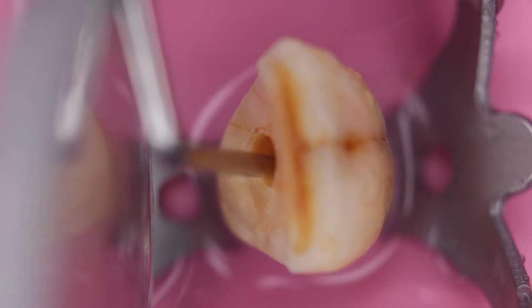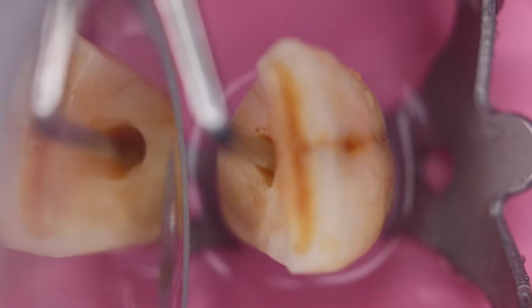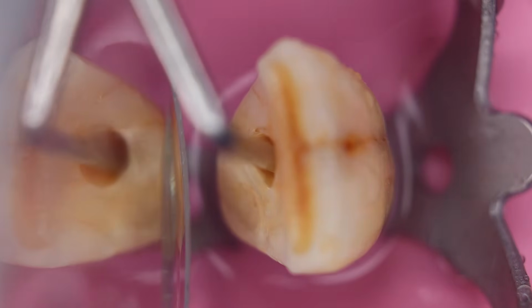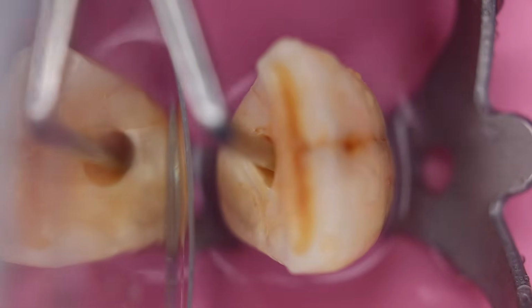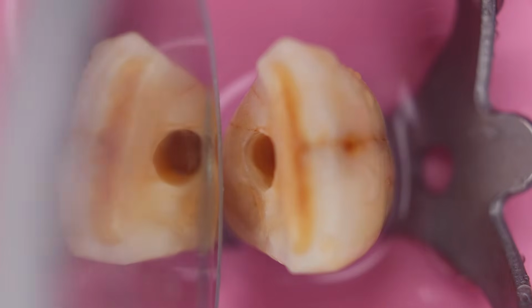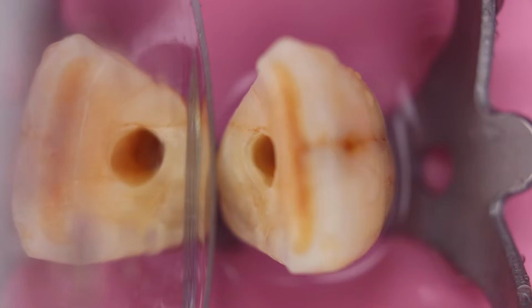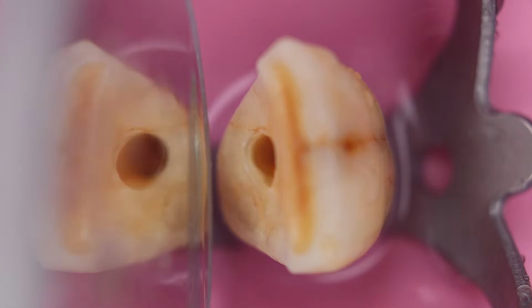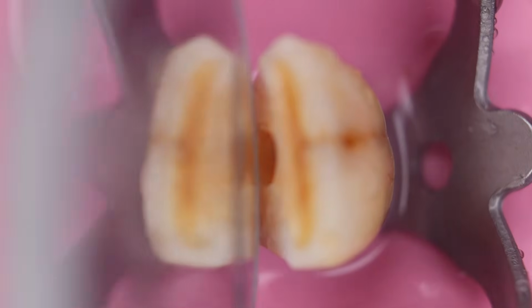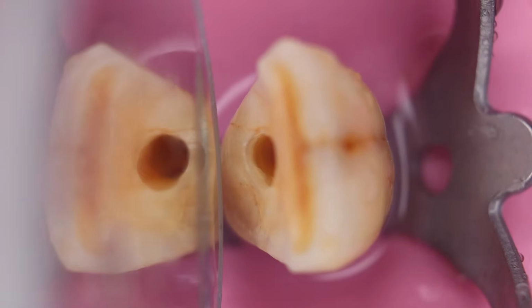So now your DG16 probe is getting engaged, as you can appreciate, in the long axis of the tooth. So you have obtained that access into the canal orifice, as you can appreciate over here. So this is the time you can negotiate the canal. So let us magnify it further so that you can see it more clearly, the orifice that we can appreciate.